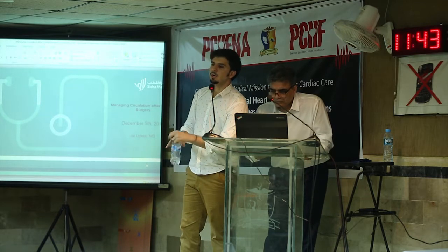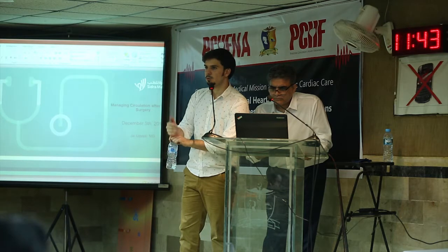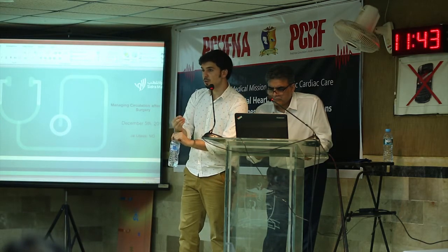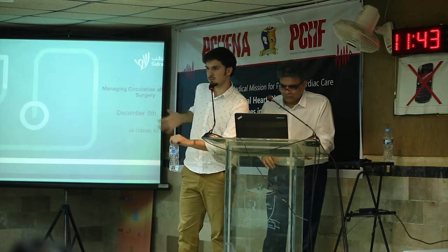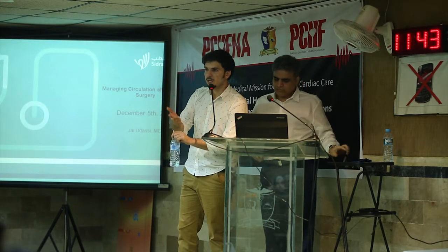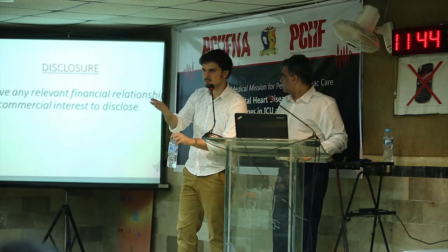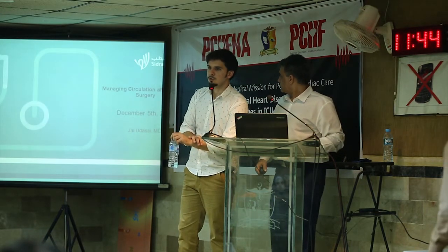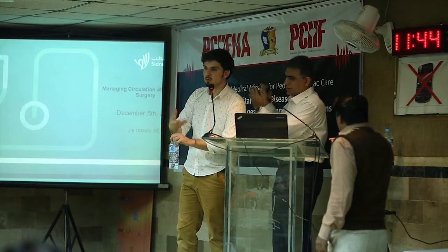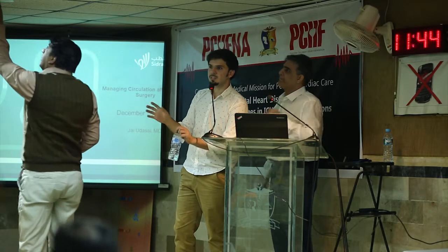CPAP, okay. Yes. The problem could be that most of the time no one likes CPAP. So what we do, we start with CPAP and the child is irritable. We have experienced pneumothorax to the point that the whole lung is gone. So then we came up with something like chloral hydrate. They say chloral hydrate is a much more tolerable sedation, which can be anything that you are comfortable with. So using sedation with CPAP or non-invasive ventilation is much more helpful. You give the patient time to adapt to the system, and later on he will be smiling on this thing.